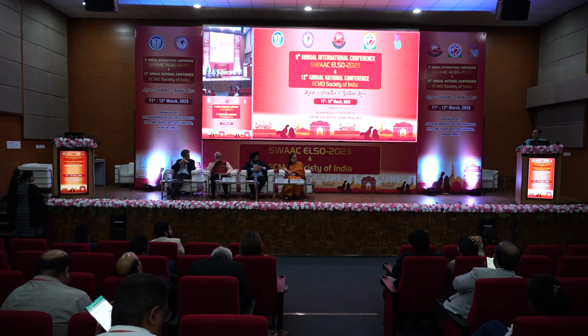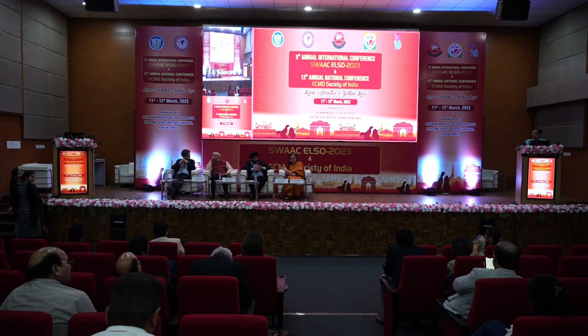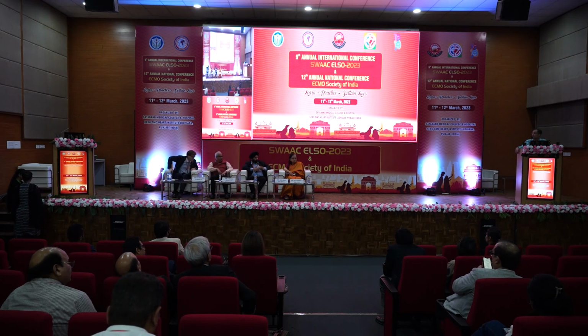One way of looking at it, and I think others can add to this, would be after going on ECMO, what is the compliance? Is the lung improving? Is the lung getting its rest and getting better? Then probably there is no need to do that. But if we find that the lung is not improving after a period of up to 3 or 5 days, then perhaps it may be worth a try.